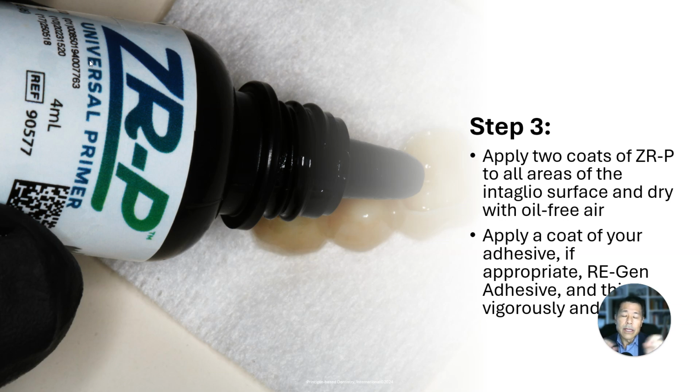And what you'll see is it'll kind of blow off, and then keep hitting with air, and you might see it rip a little bit, and all of a sudden there's no movement that you can observe. That's when you've got it thinned out adequately. Now you can take your favorite adhesive, as long as it's not too thick. Remember, know what your adhesive is like.